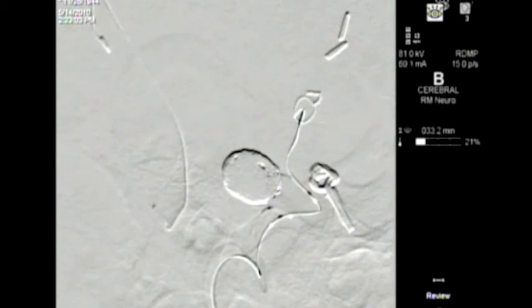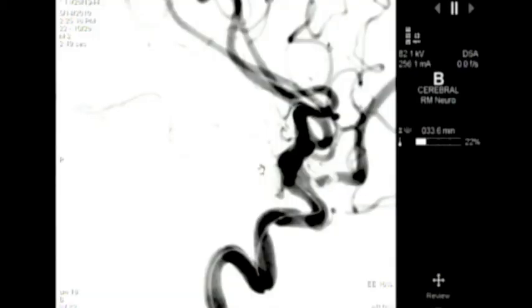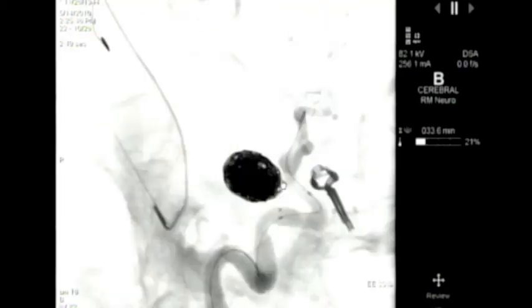Here is the last coil going into the aneurysm. Here is the final picture after the coil embolization. You can see the aneurysm is completely coiled and the parent vessel is completely patent.